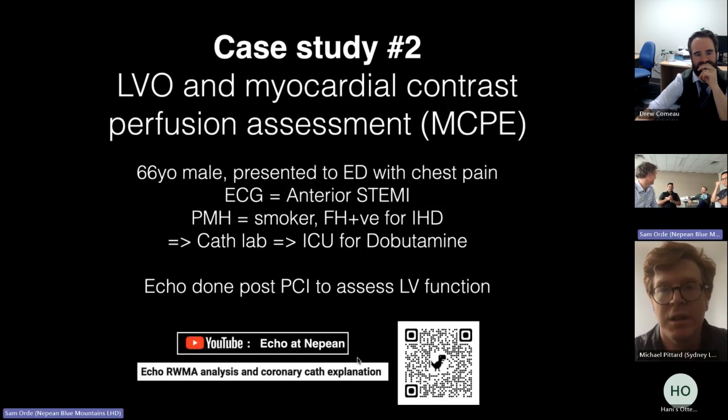Maybe just using the term ultrasound enhancing agents instead of contrast will lay it away. Oh, man. It's Michael. Can I ask?